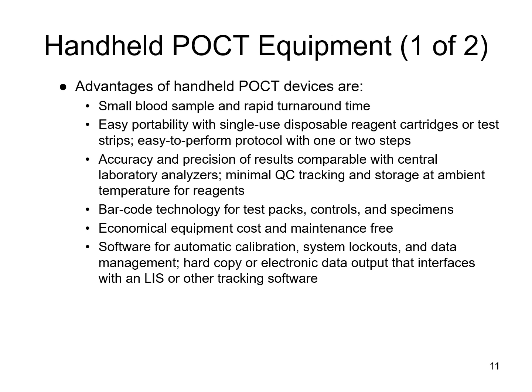And in the meantime, you could go ahead and start working with that patient as far as options for treatment should those results come back and confirm that hemoglobin result. And these analyzers also have the capability, most of them, of being connected to some sort of LIS, or laboratory information system, to transmit those results so that they are stored directly into the patient chart.